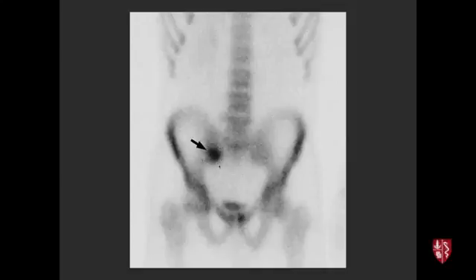And this gets to the pros and cons of a bone scan. It's very high activity, but it's not very specific as far as what it is. This could be a tumor, it could be infection, it could be a stress injury to bone, and without good clinical context, you may not know which of those things it is. If it's a stress injury, like an overuse injury, you can't tell on a bone scan whether it's a fracture or not. So it's extremely sensitive, very useful for things like screening for metastatic lesions in bone, looking at bone tumors, somewhat for stress injuries. But MRI has taken over a lot of what nuclear medicine used to do, at least in the bone scan world.